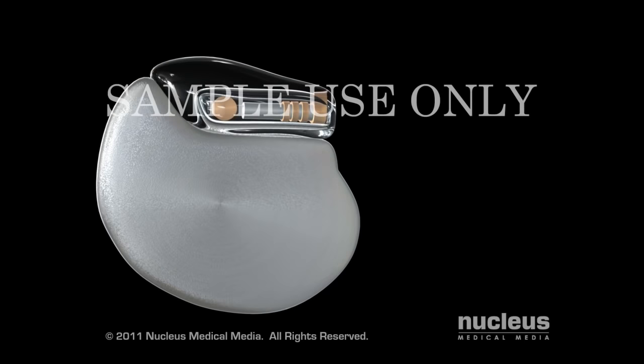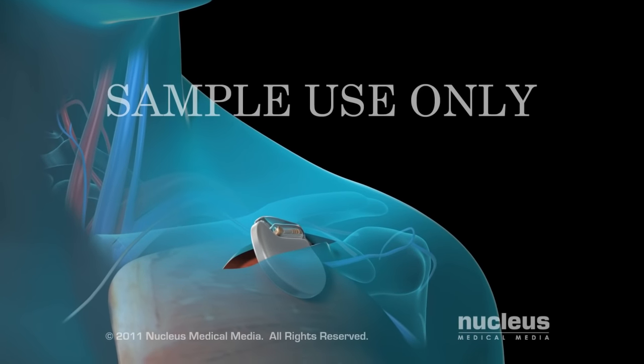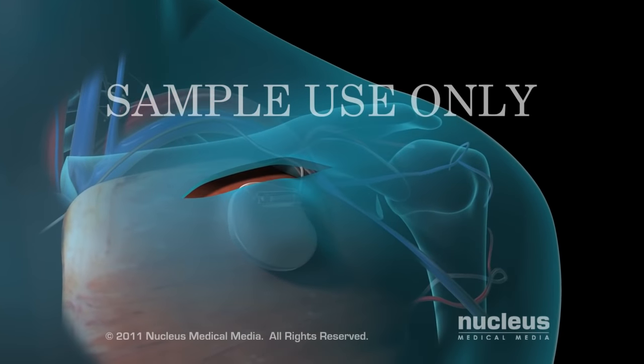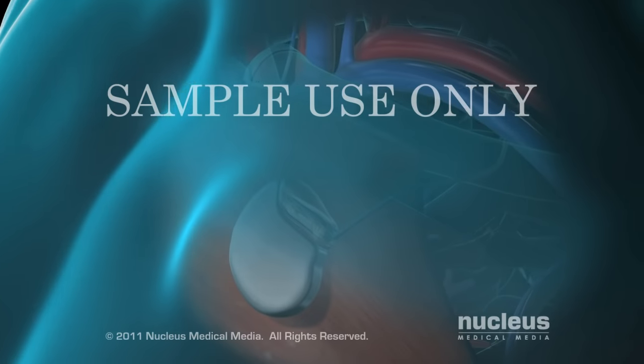Once the leads have been tested, they will be connected to the pulse generator. The pulse generator will then be placed in a small pouch that your surgeon will create under the skin beneath your collarbone. Your surgeon will then sew the incision back together.